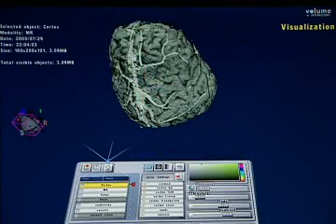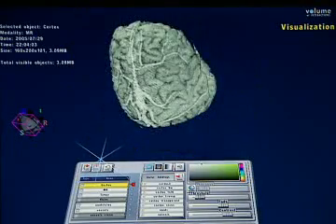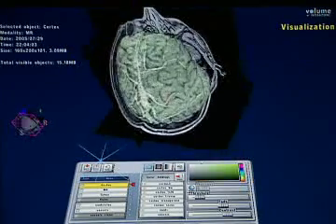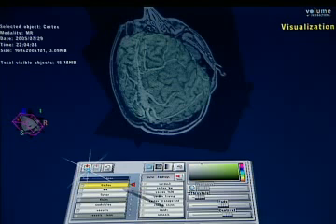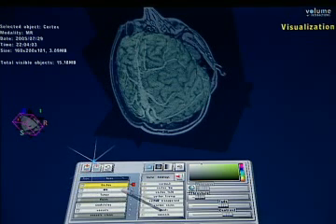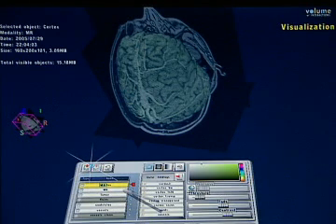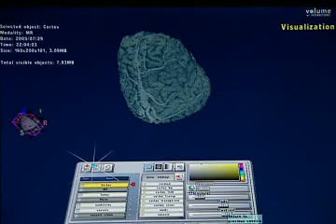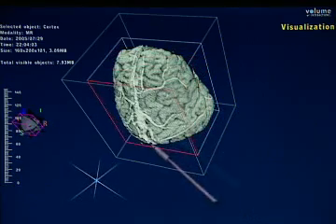You can also get a nice idea of what the cortex looks like. Going to the surface, you can see the surface rendering very similar to what you see with stealth imaging, where you see the fiducials right at the surface. But here you get a beautiful cortical rendering that can really guide exactly which gyrus you're going through if you're going transcortical or transcallosal. In summary, using just routine imaging, you can get really nice 3D perspectives with views of vessels, tumor, cortex, and surface.